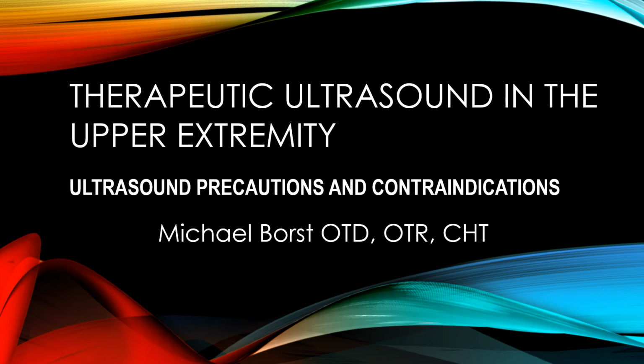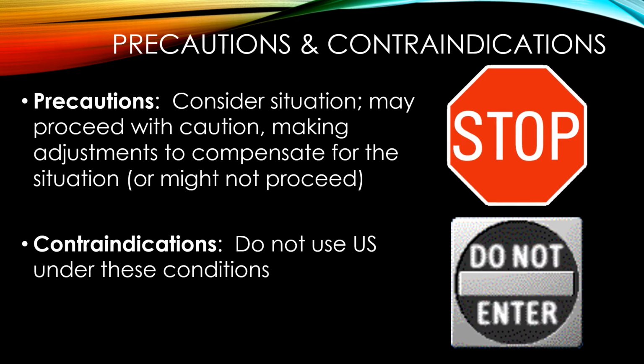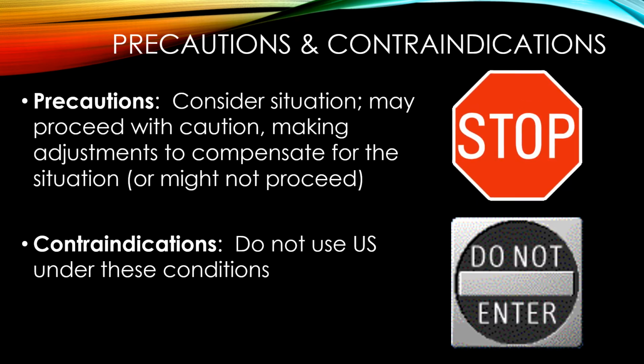In this video, I want to go over the precautions and contraindications for therapeutic ultrasound. First, we need to define what we mean by precautions and contraindications.